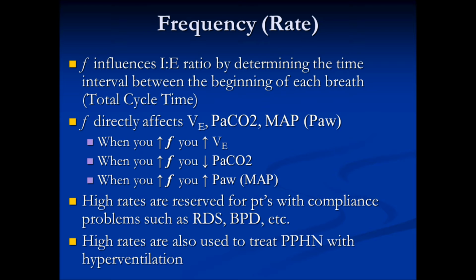When you increase your frequency, you also increase the average amount of pressure, which is your MAP, mean airway pressure. And a mean is the average of anything. So the average pressures in your airway. And that can either be signified as PAW or MAP.